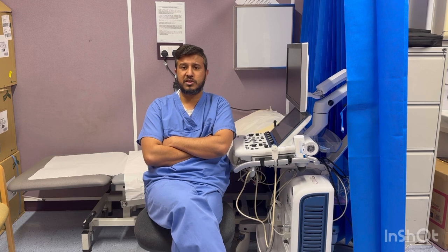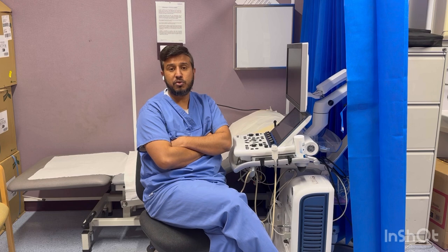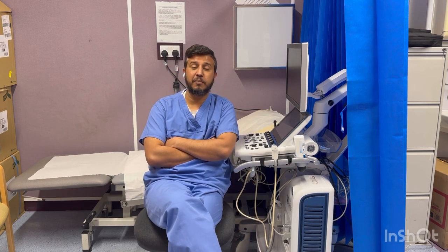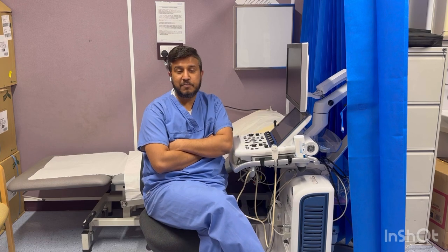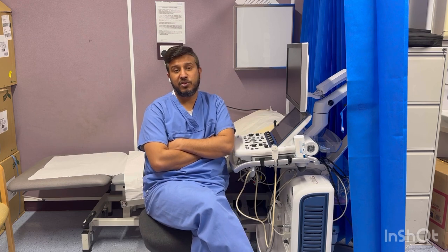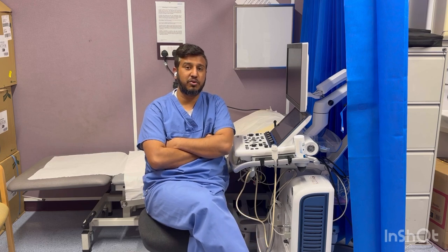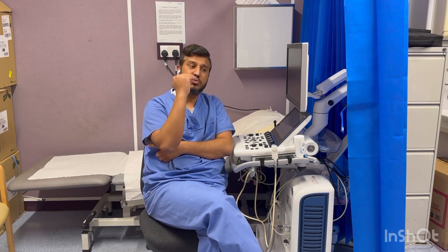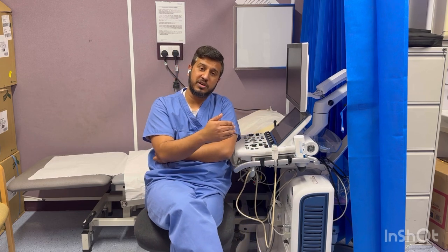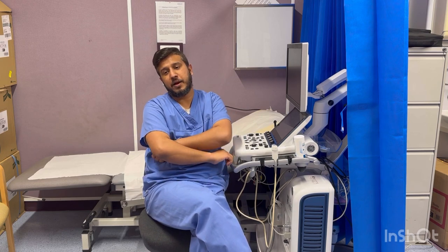The next technique is color Doppler. Color Doppler is a form of Doppler — we use mainly two colors: red and blue. We use a convention called BART convention. Color Doppler helps us determine blood flow direction. BART means Blue Away, Red Towards — so blue indicates flow going away from our probe and red indicates flow coming towards the probe.